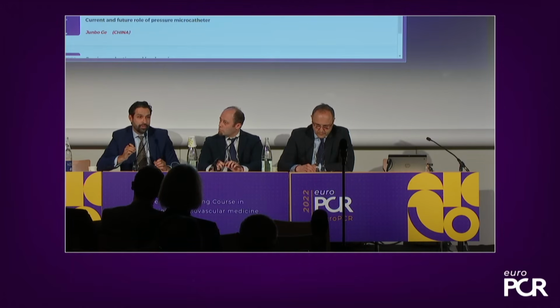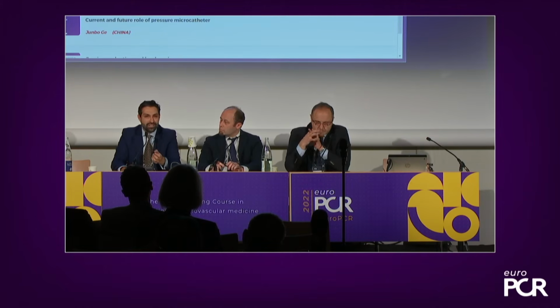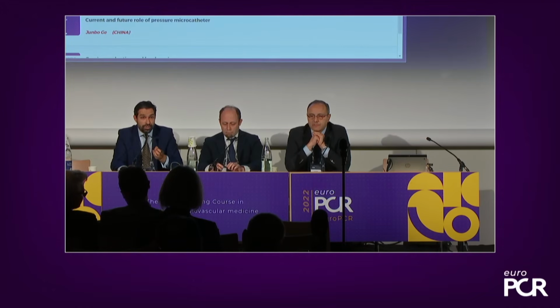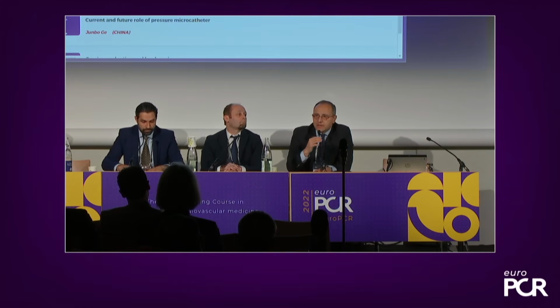Why is this important? Because PCI is a focal therapy. So if, and you have seen the data that I presented on angina, we treat patients with focal disease, that patient will do pretty well. That's a patient that will come without any residual symptoms, and we believe that those patients, based on the research done on post-PCI FFR, will do pretty well long term. In contrast, when we do PCI in patients with diffuse disease or low PPG, these patients are the ones getting low post-PCI FFR, less improvement of angina, and maybe higher event rate at the long-term follow-up. This is what we would call PCI planning, actually. You're anticipating already what you could expect after stenting the vessel.